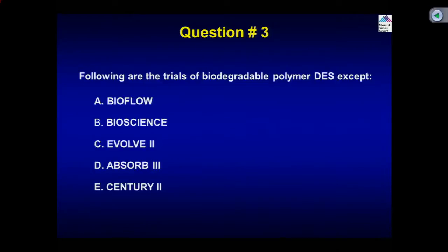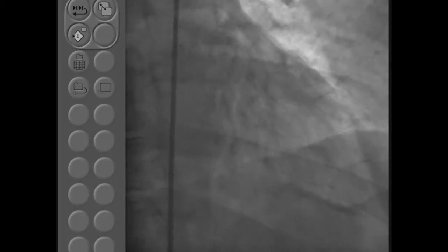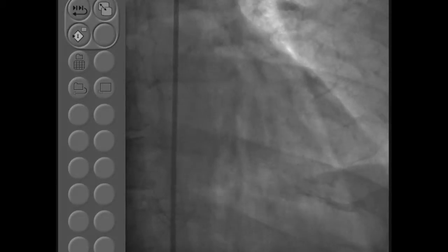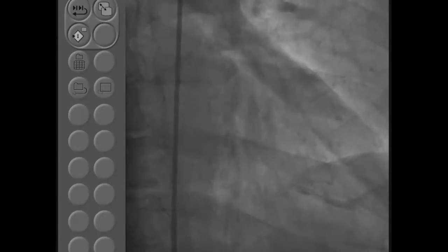So with that note, I think you want to take a little picture of this particular case just to make sure that things are all right. Patient is hemodynamically fine. I think this is the type of case where you need to abort, don't be a hero, and bring the patient back about 6-8 weeks, knowing that he is not symptomatic. He is ischemic, but not symptomatic.